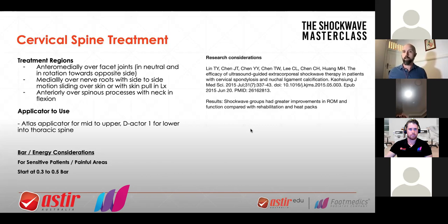If they say not much better but not worse, we'll keep applying. Or they might say I'm getting better — good, we'll keep applying. Same principle. If they're not in much discomfort, you increase the bar to one, maybe 1.5. You can go higher within pain limits. We don't want to cause that much pain — just a little bit of discomfort is okay. It's uncomfortable but not 'ow, it hurts.' We don't want that guarding feeling, because that's just not going to assist in the recovery of the patient.